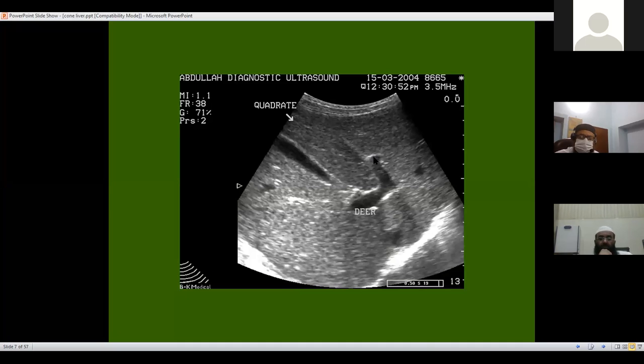Longitudinally, there you see the portal venous branches and how it appears on cross section. And there on top is the ligamentum teres, this white thing. And there you see the gallbladder. So with the help of the portal vein, we divide the liver into 4 main segments.